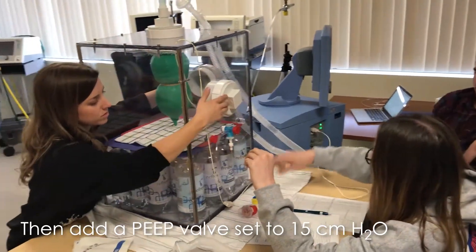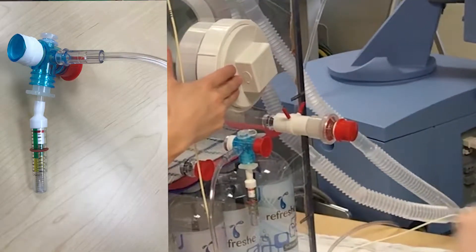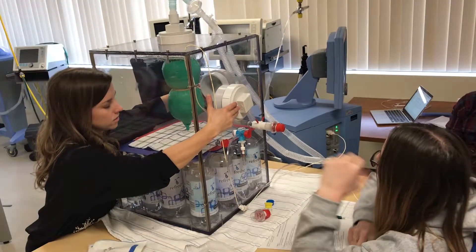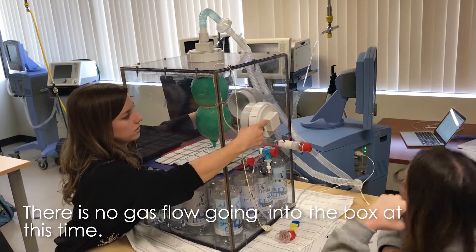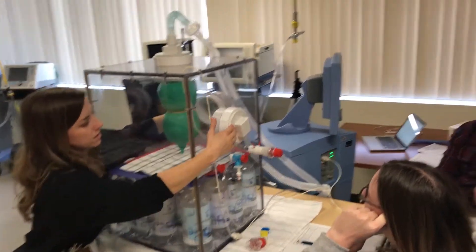There should be another peep valve with some things. So now your volume — Trevor, you put your ventilator in volume? Yep. So now go ahead and turn that flow meter on to flush.